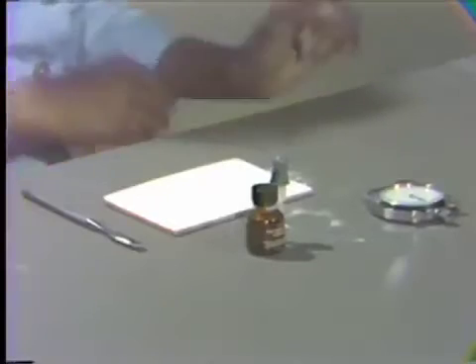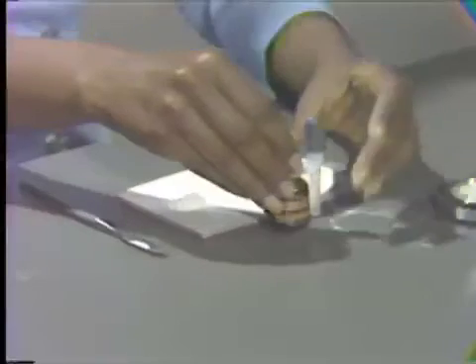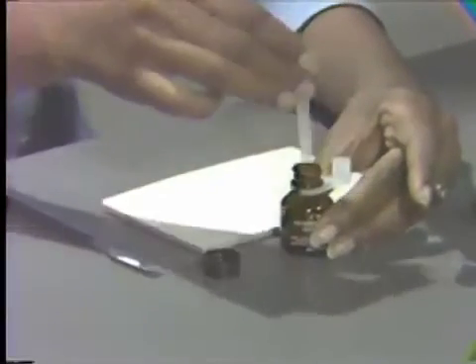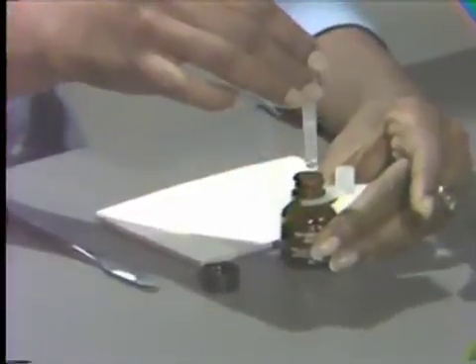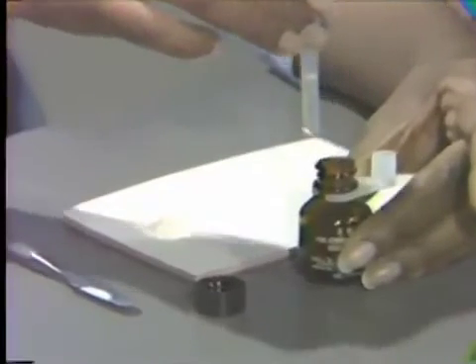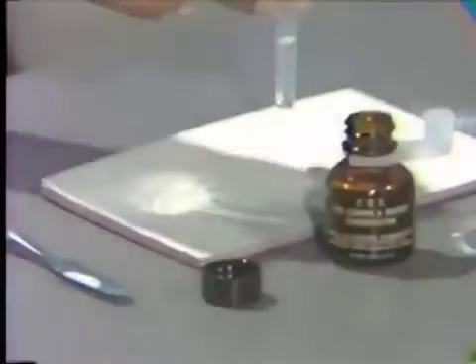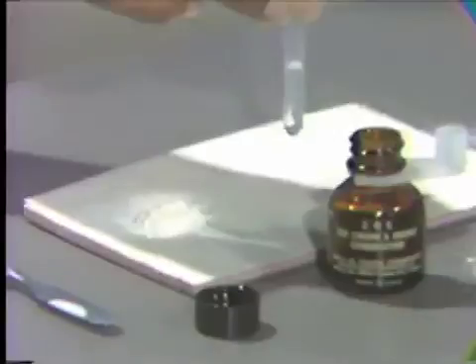Swirl the bottle of liquid to ensure uniform density of the contents. Open the bottle and fill the dropper. Keeping constant pressure on the bulb, dispense one drop of liquid back into the bottle. For consistent drops, hold the dropper perpendicular to the mixing pad. Dispense seven drops onto the pad at the left of the powder.